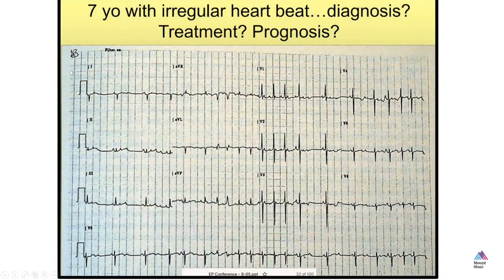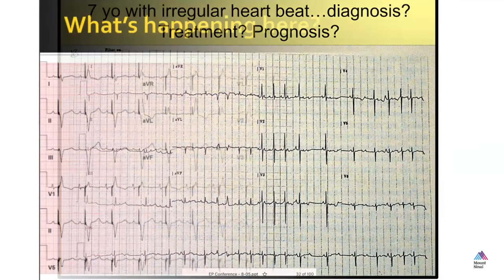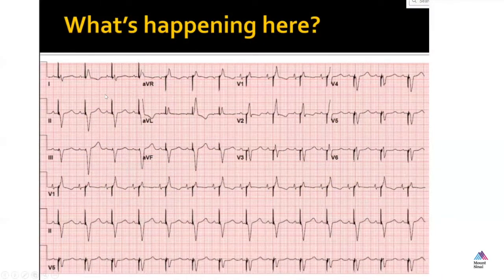Okay. I have a question about that one. Sure. If you're dealing with that, and that's happening, would you then lengthen the pacemaker's sensing time, if we want to try to preserve the patient's natural conduction, so that with that little bit of extra time the pacemaker is able to sense that?